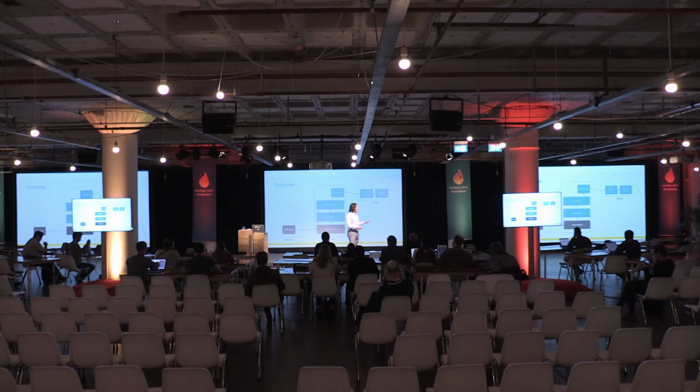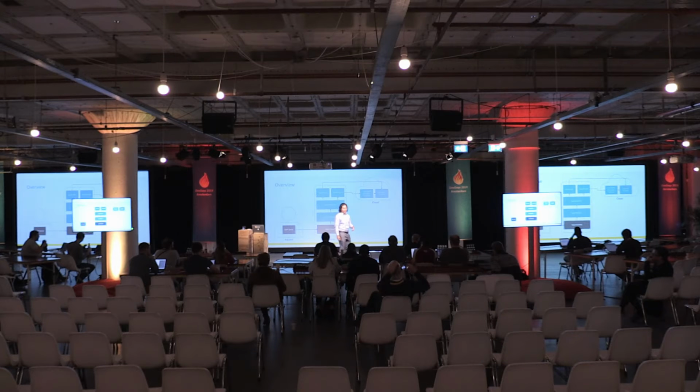Now, there's another path for the data, which is we can use the Swift Smart framework, which was developed by Pascal and some other folks. Is Pascal here? He works at Apple. I'm not going to really go into this because I want to focus on the IoMT FHIR connector for Azure. It has a lot of functionality as far as handling high-frequency data, so things like the Apple Watch can sample every 5 seconds. If you are in exercise mode, your heart rate will be measured every 5 seconds and then put into the cloud. And creating a resource for 720 observations of heart rate every hour is going to blow up your FHIR server.